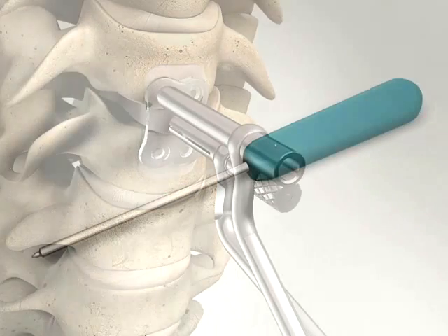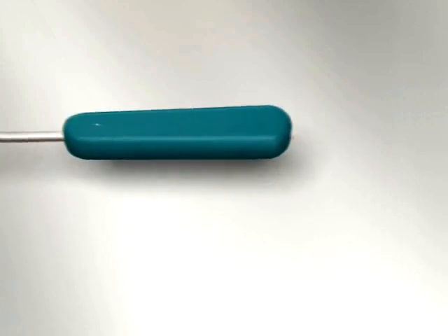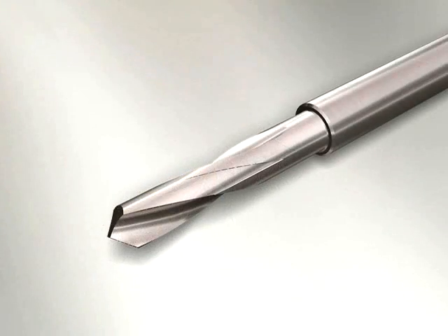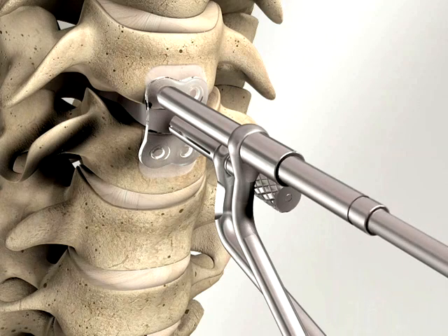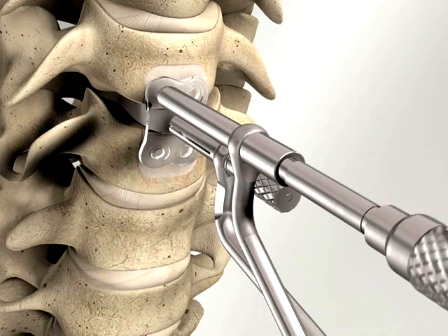Before drilling, an initial starter hole must be made using the bone punch instrument. Always position the punch instrument through the drill guide. Use the special drill to create a hole for the self-tapping temporary fixation screw.